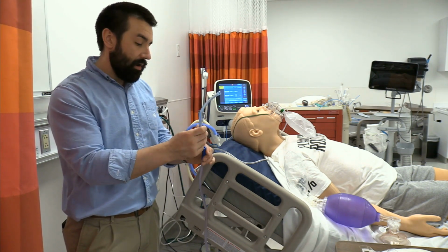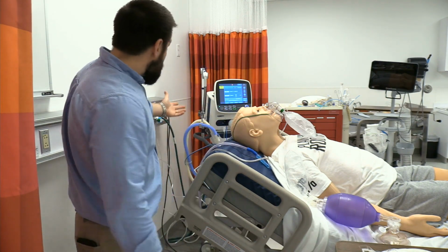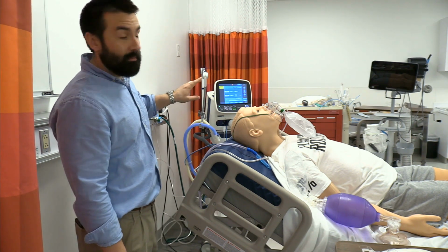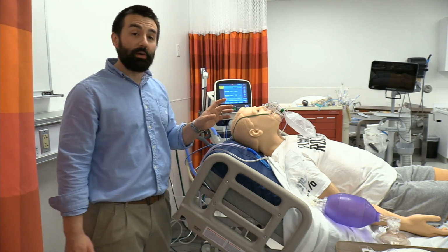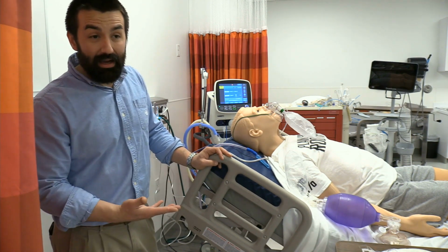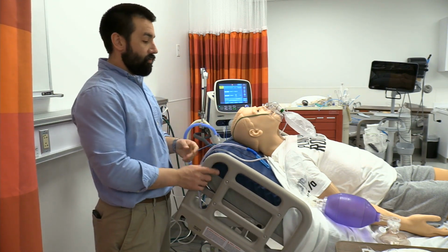We're going to use a Yankauer in order to clear those thick, nasty things that can block our view. Not 100% required, but I do like having the ventilator, if I have a little bit of time, with appropriate ventilator settings in, plugged up, and ready to go with just a gentle little reach there, because you are going to be providing manual ventilation afterwards. Sometimes you don't have time for this and you're calling somebody else to bring you a vent, but when you do have the time, I do like to get it set up and out of the way, but close enough for reach and ready to roll.